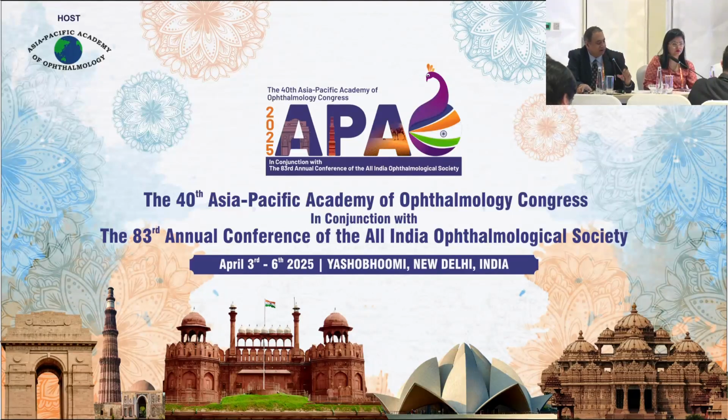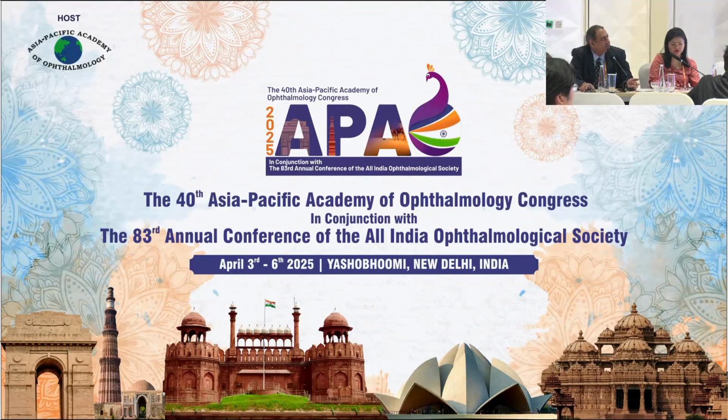I think great work and really congratulations. The major challenge in India is that we don't have so many fundus cameras. We have 130 million people with diabetes, and we cannot have so many cameras to take images. So if we think that every year we can have something which can be used as a screening, probably some other method, like one of the things which we have been trying is the risk factor based approach, so that we can triage. The good thing in India is there are a couple of good population based studies which have identified risk factors, and so what we have tried looking at is, can we use these risk factors to triage patients to get a photograph, because you cannot take a photograph for all. So that is something probably in our country that may be the way to go.